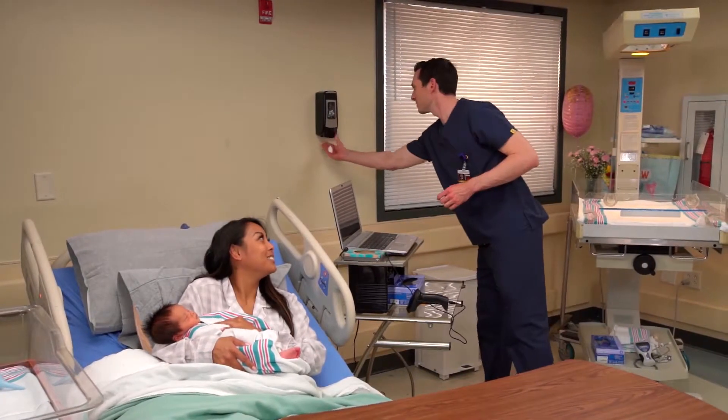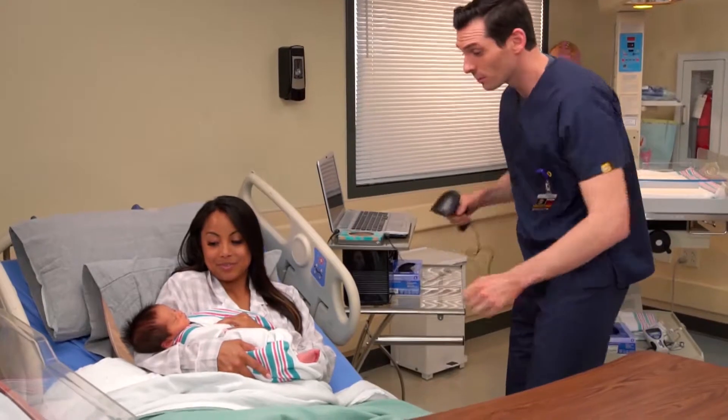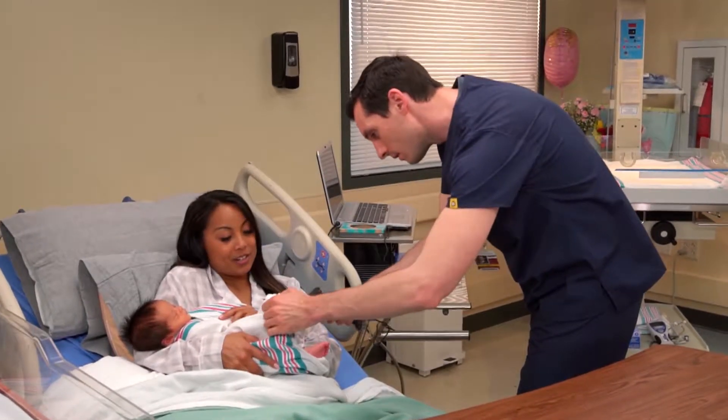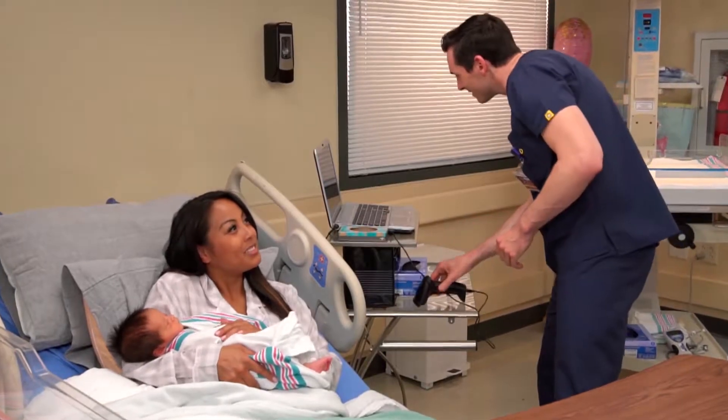Hi, Lynn. My name's Mateo. I'm here to take Chloe's vital signs. Is that okay? Yes, that's fine. Great. Can you tell me her name and date of birth? Her name is Chloe Huang and she was born yesterday. Thank you.